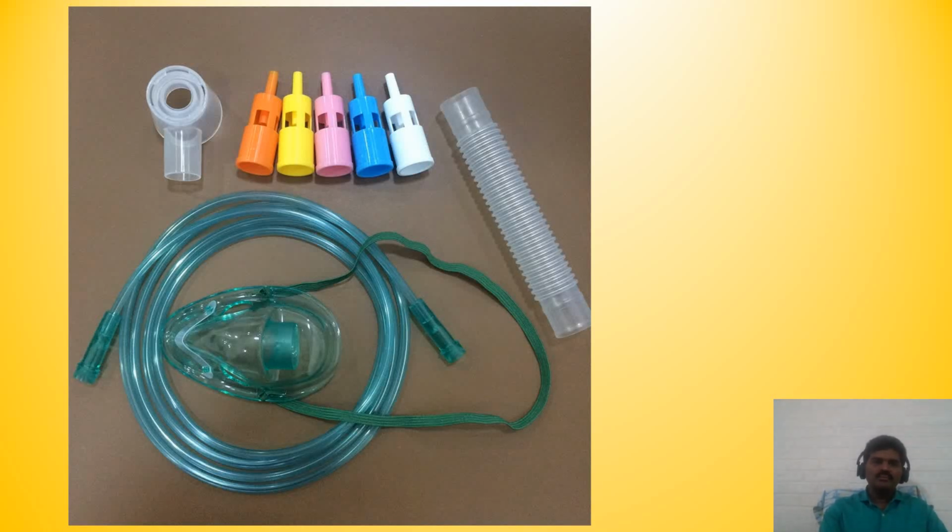There is a tubing, there is a mask, multiple connectors are there, and then these are the color coded actual Venturi mask controllers, where the FiO2 is marked on each of these ports, and you can use the exact port for the amount of FiO2 you need. Again, as I told, the amount of FiO2 delivered depends on the size of these entrainment ports. If the size is less, the FiO2 delivered will be more. If the size of the entrainment ports is more, more air mixes from outside, so the FiO2 delivered will be less.